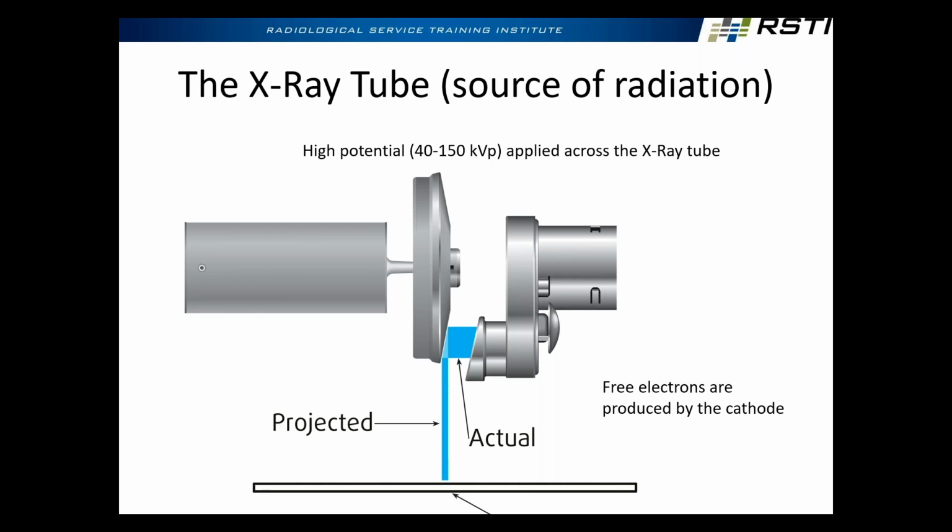That it would allow us to produce X-rays of shorter and shorter wavelength, higher and higher frequency, the higher we go in kV. So with your kV selection, what did we say we were going to base kV selection on in general? Well, not mass like atomic mass, but patient thickness, right? Yeah, don't overthink it. Patient thickness. And so the higher we go in kV, the more penetrating ability we have.